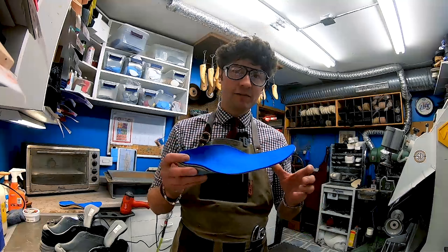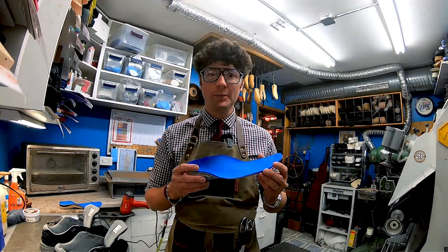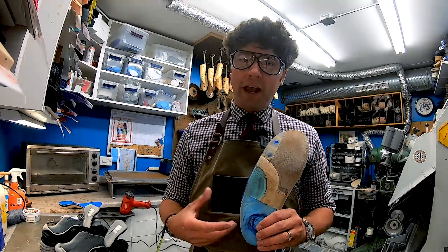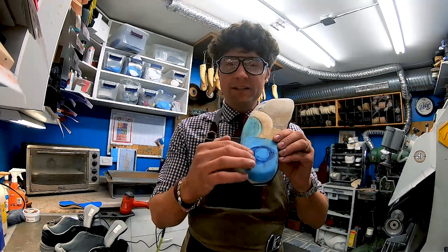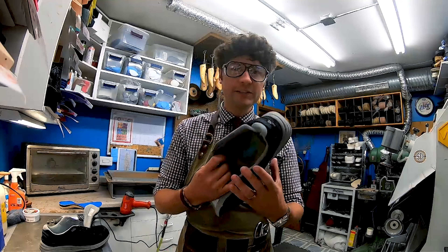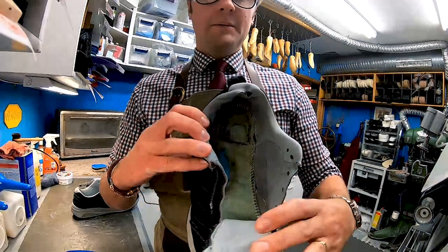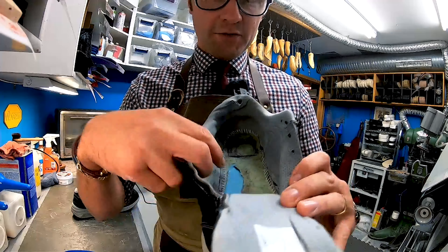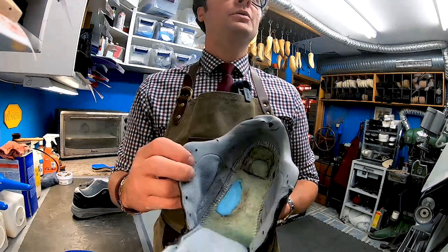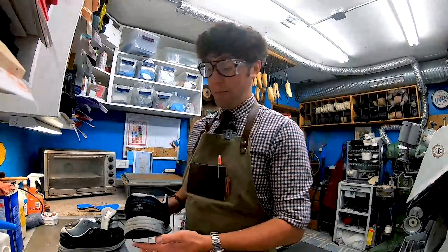She got set up with a new set of orthotics and shoes from us and was doing well for a couple of years. Within the last year she's had some opening, more callus buildup at the base of the heel as well as the cuboid, so we're working on more offloading. About six months ago we did a drill and fill on the cuboid area and that worked out really well. Today we're doing a drill and fill right at the base of the heel.